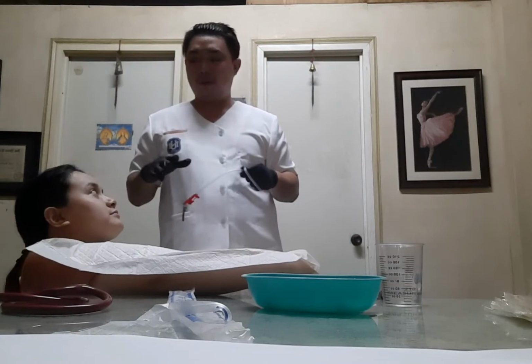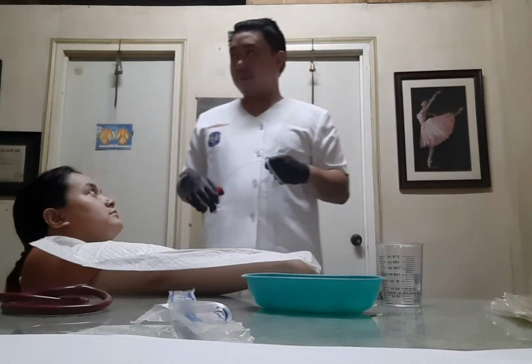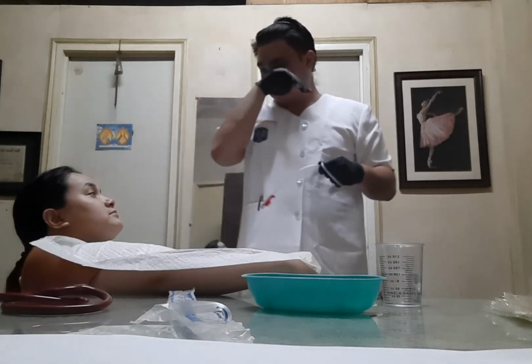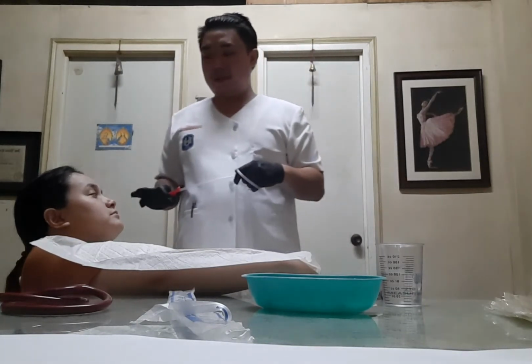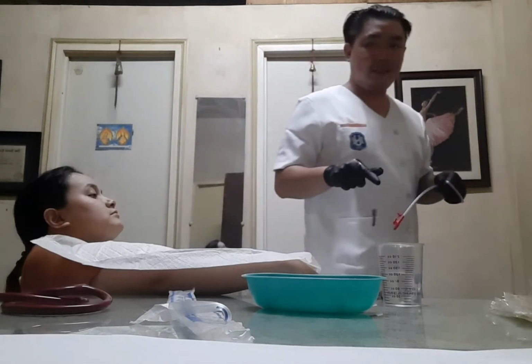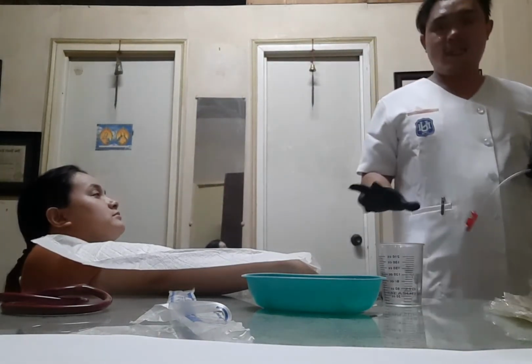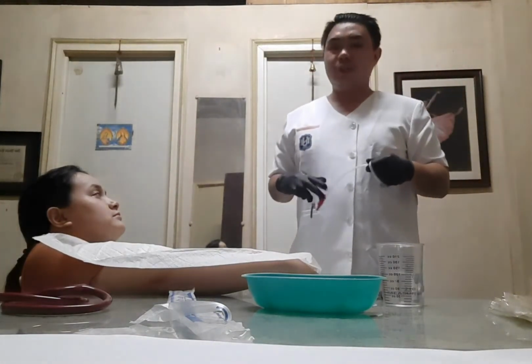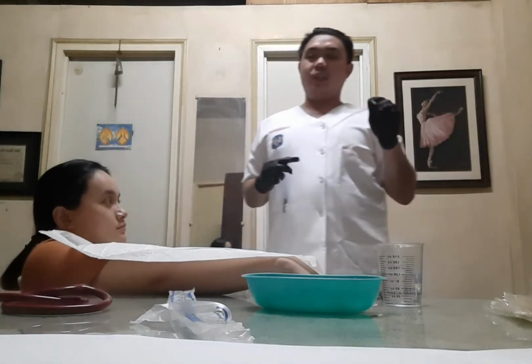Explain to the patient the importance of coughing during the suctioning. And then after explaining this to the patient, check the patient's pulse rate. It should be normal, and then wait for another 2 minutes before you insert the suction catheter again.